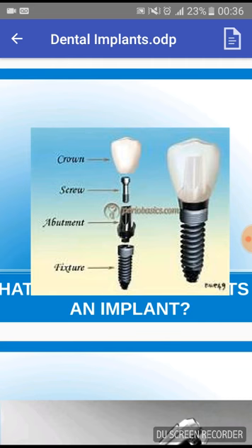Okay? What are the properties of a good implant? You don't want to put an implant into a person's mouth and it starts to rust. So, one, it must have good corrosion resistance. It must be biocompatible, low in toxicity, because remember some elements can be very strong and very corrosion resistant, but they actually release ions over a period of time. This can result in slow metallic poisoning.